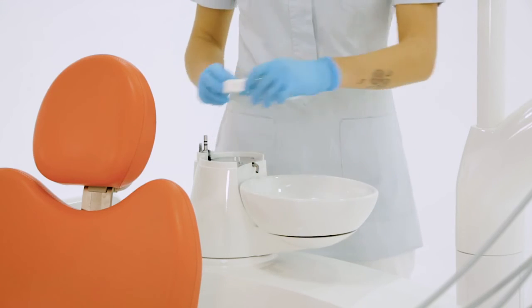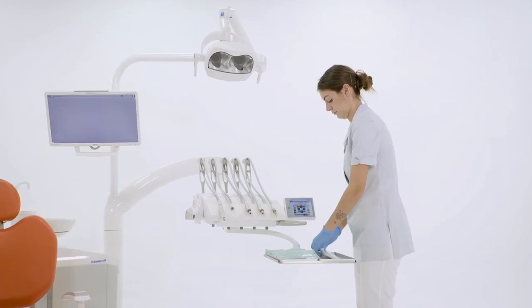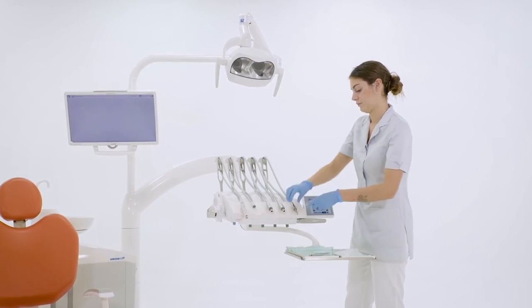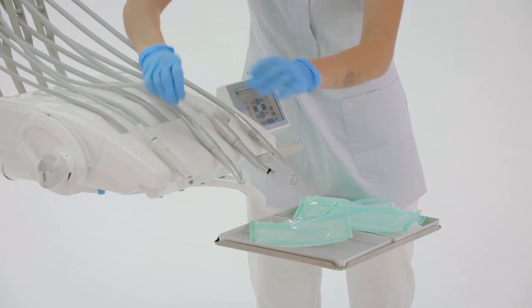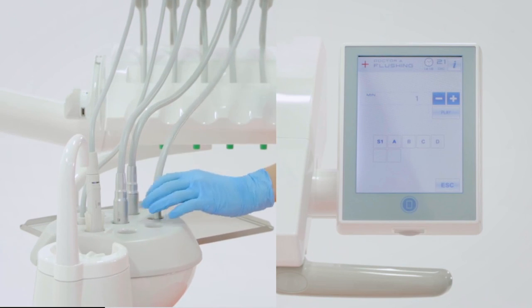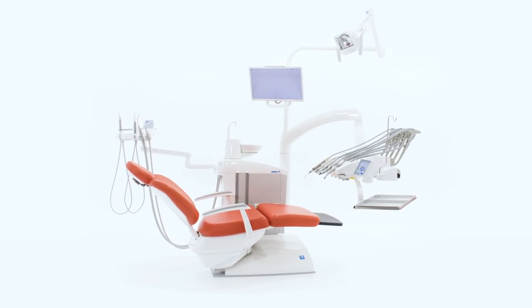To complete the tasks at the start of the day, the assistant puts back the sterilized and disinfected items and applies the required disposable covers. Before treating the first patient, a circuit flushing cycle is performed using the IW FC device. The unit used in this video is the top-of-the-range unit S380TRC.